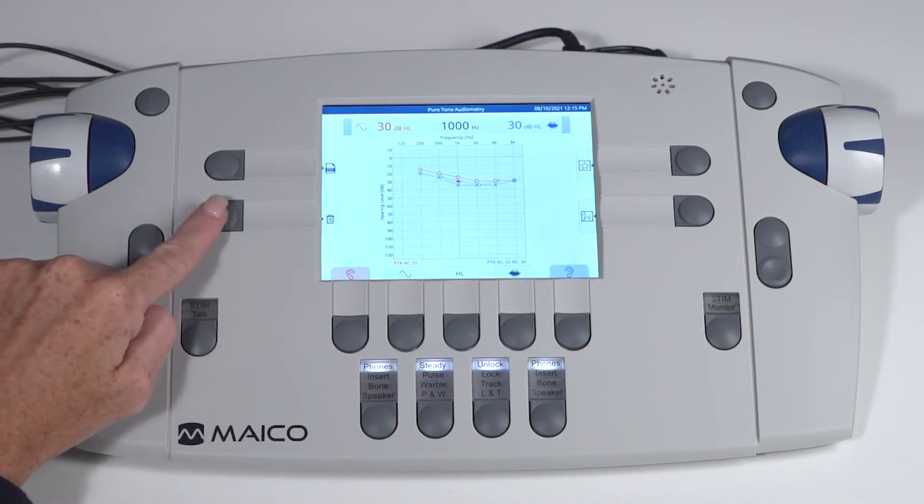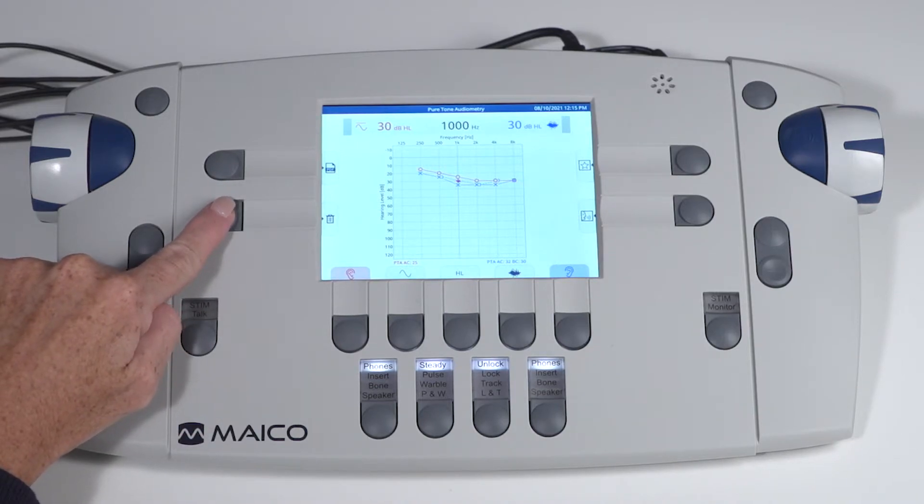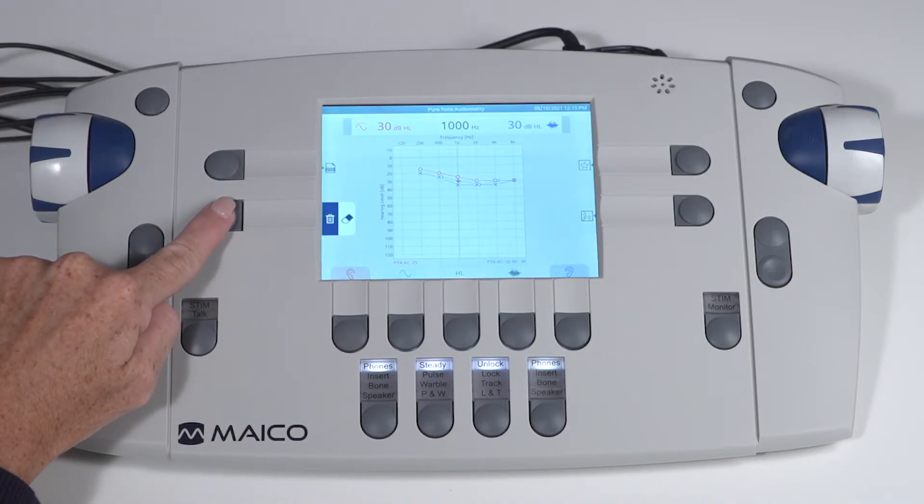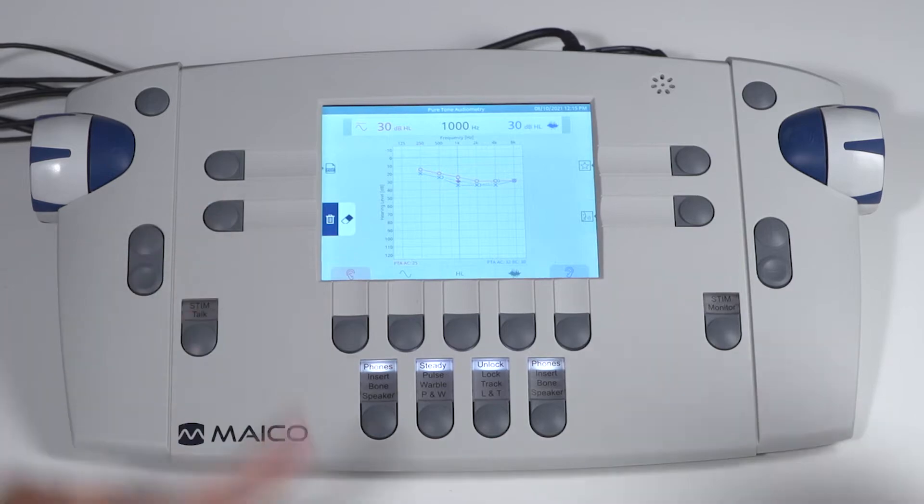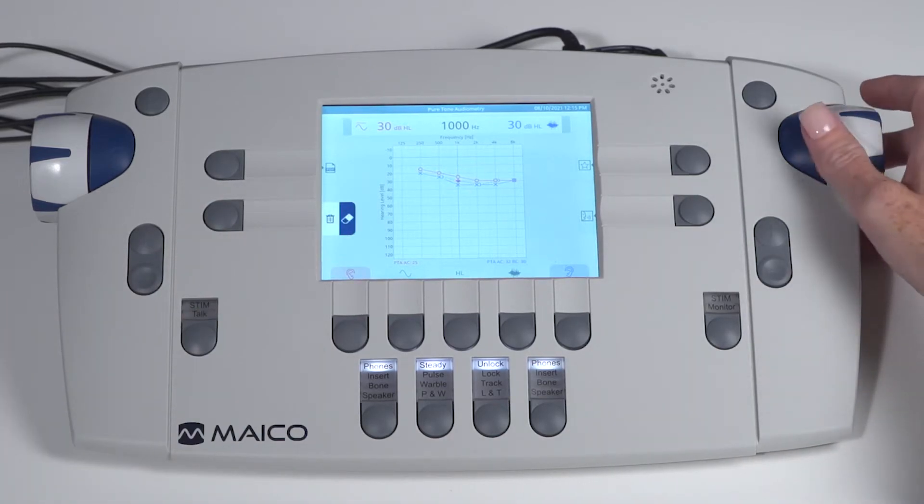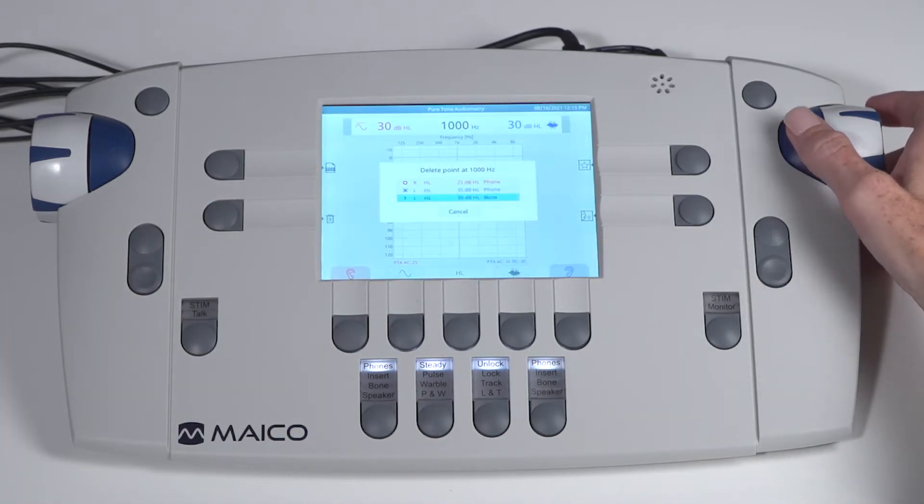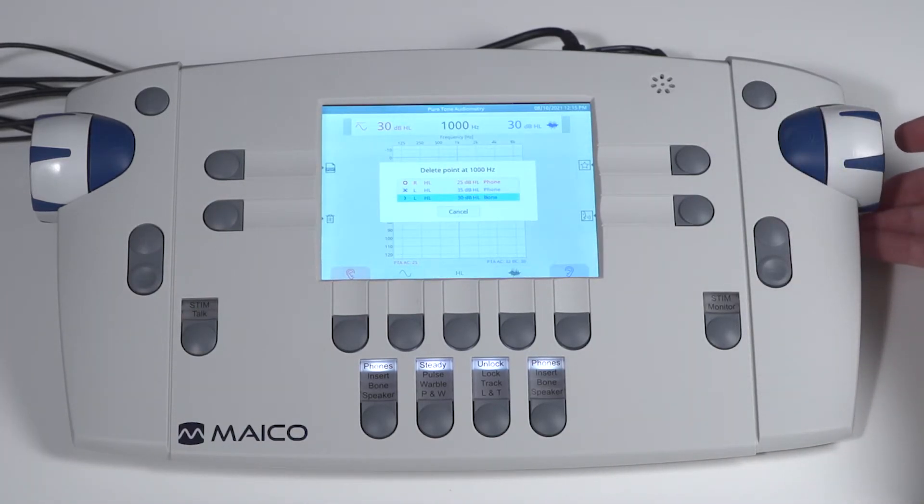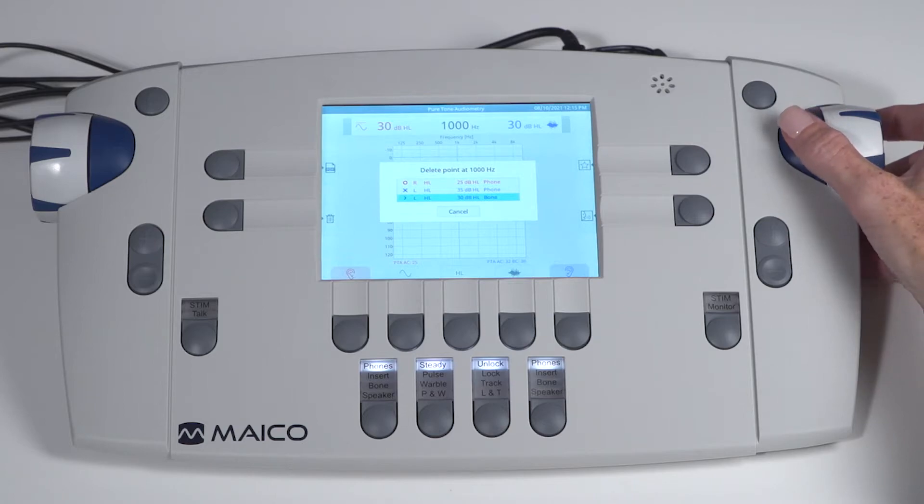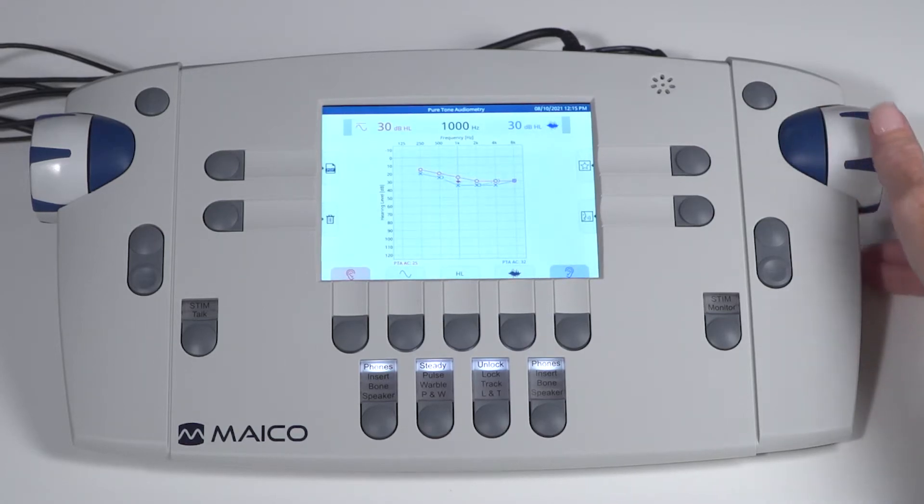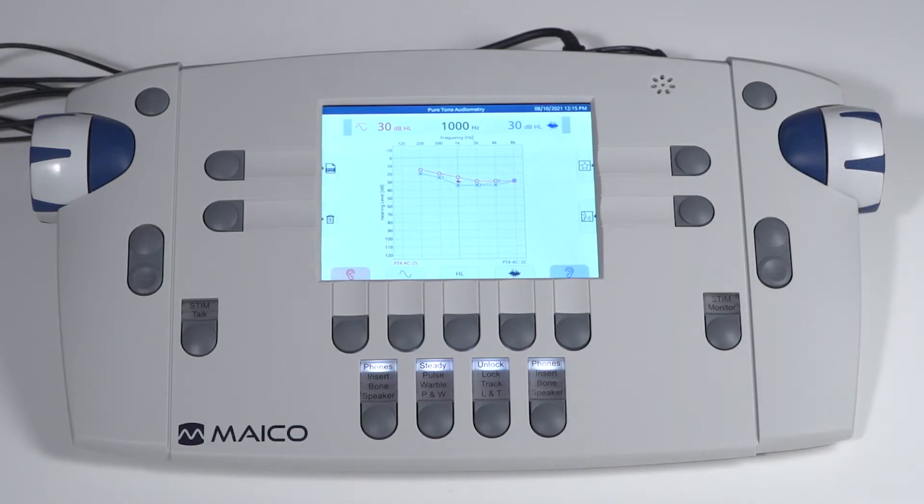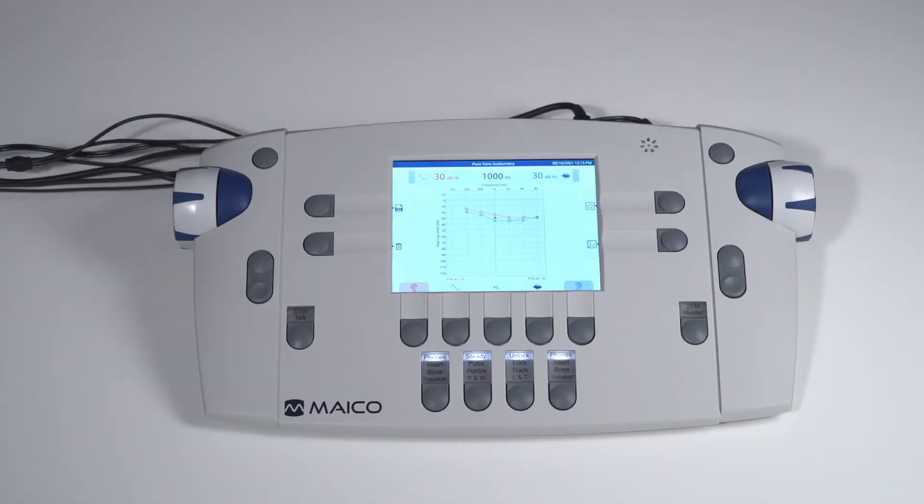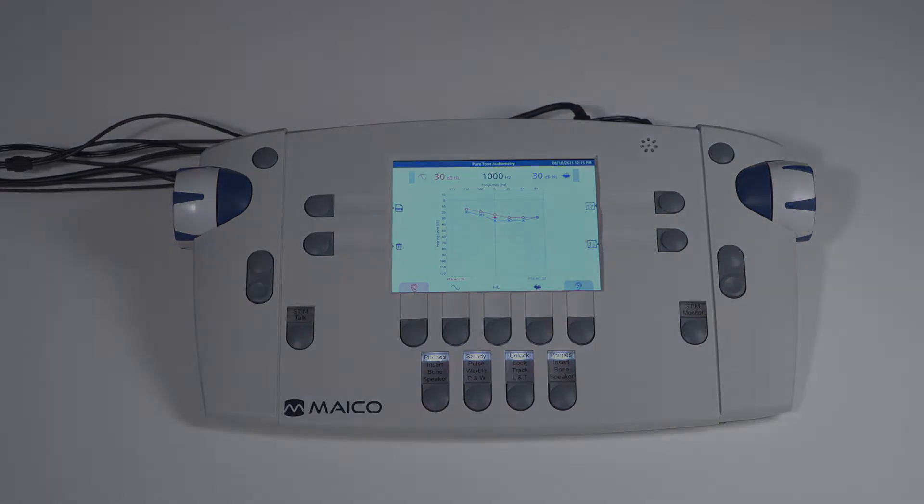For example, with this key, if the quick select is activated, all the results will be deleted. To activate the advanced select, simply hold down the key to reveal the additional key options. Once the key has expanded, use the dial to highlight the selection and press the present key to complete the action. The quick guide that was included with your device provides the definition for each icon.